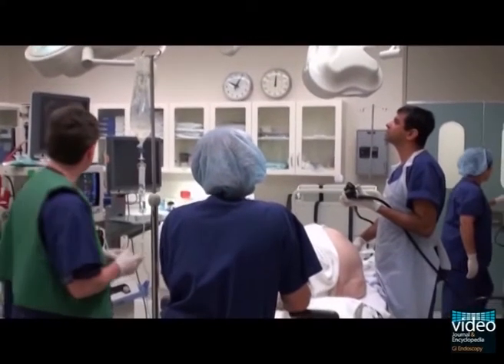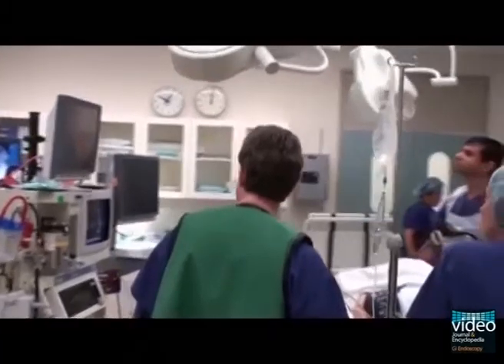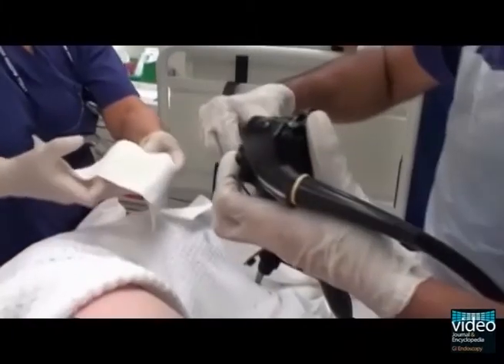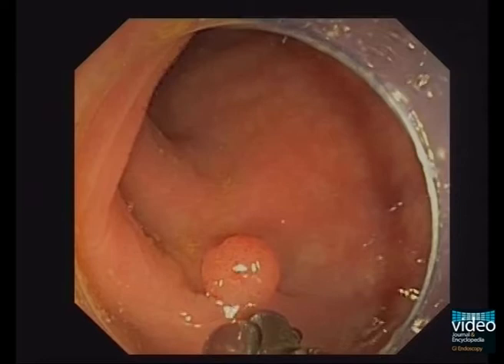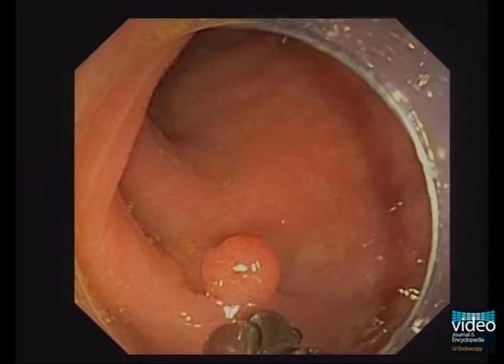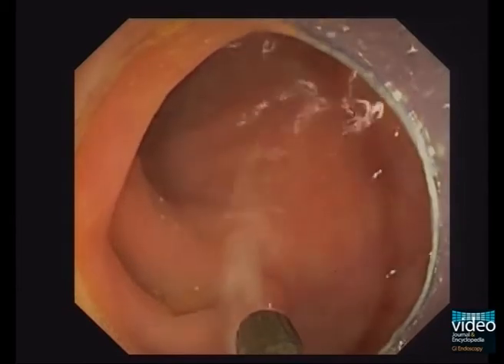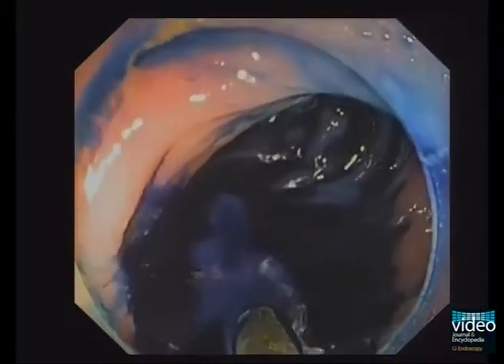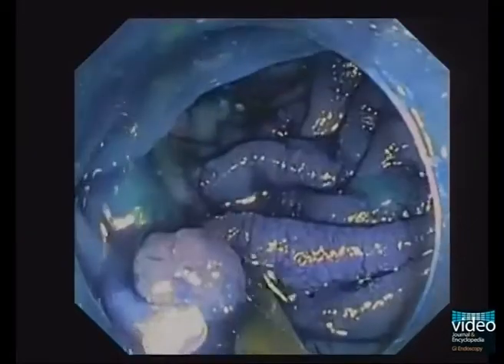Visualization of the cellular structures is enhanced by application of a double stain technique which approximates hematoxylin and eosin (H&E) staining in conventional histology. The surface is first treated with a mucolytic agent, 10% N-acetylcysteine, followed by application of 1% methylene blue which stains the nucleus, and 0.1% crystal violet which stains both the nucleus and the cytoplasm.